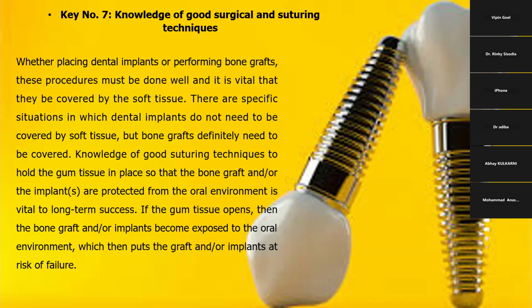So, knowledge of good suturing techniques to hold the gum tissue in place, so that the bone graft or the implants are protected from the oral environment for long-term success.